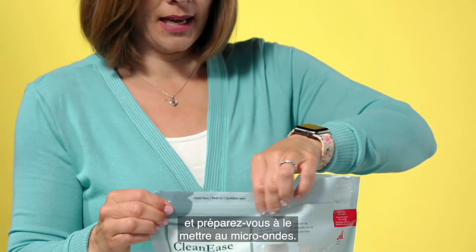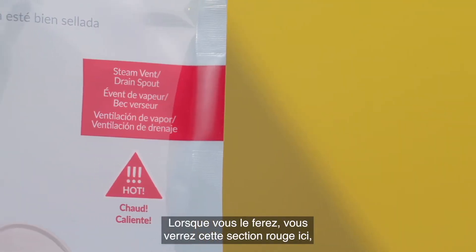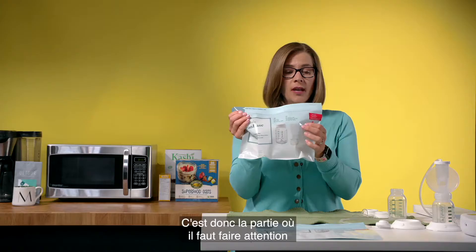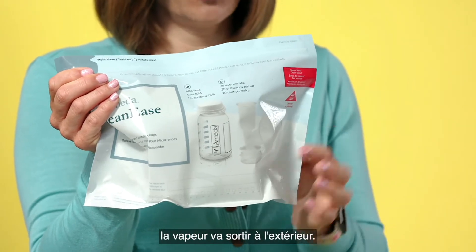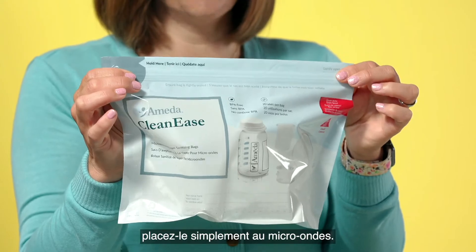Then simply zip up the bag and get ready to put it in the microwave. When you do, you'll see this red section here. This is the steam vent, so this is the part where you have to be careful because when the microwave heats the water to sanitize the parts the steam will come outside. So when you're ready to go, you simply place this in the microwave.